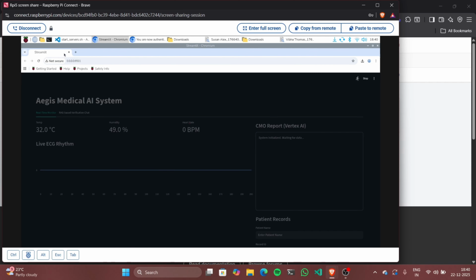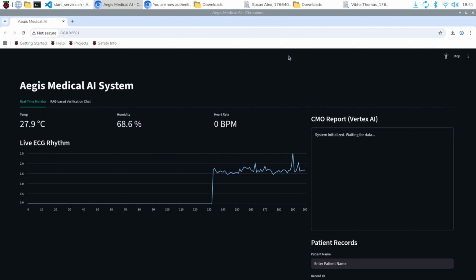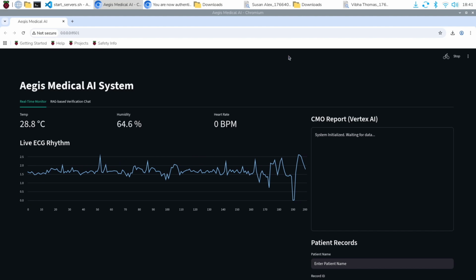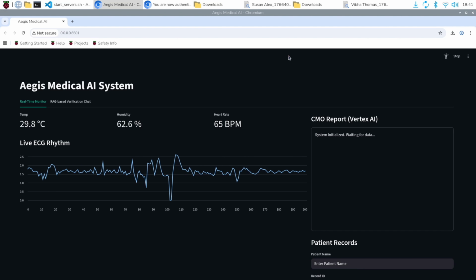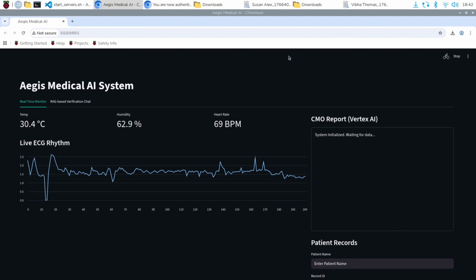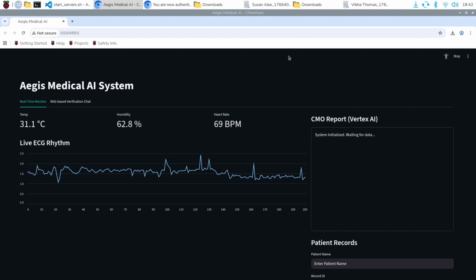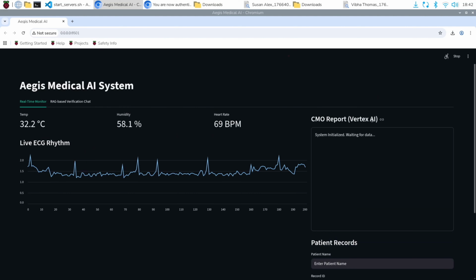so this is the UI. I've created the UI using Streamlit, and it takes a few minutes for the values for the sensors to kick in. So like I mentioned earlier, I have normalized the ECG monitoring. If you notice, I have removed the noise. Whenever there's any small movement, the voltage that is captured is very sensitive, so there are a lot of fluctuations if I move. Soon in the video you will see when I'm trying to move, and there are a lot of fluctuations, but the value has been normalized to remove all the noise.